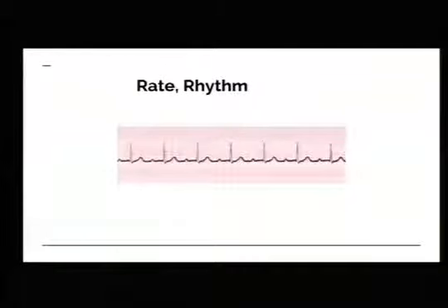What do you see in this one? Yep, because your PR interval is greater than 0.2. So just prolonged here. And for the love of God, don't ever tell a patient they have a long PR interval. They'll be all distressed about it, and it really means not much. So just tell them it looks good.